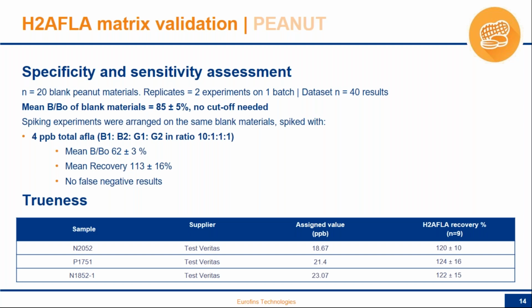We verified that they were blank, again, through instrumental verification, analyzed them in 2 sessions and found no matrix effect. We are very happy about this result because peanut could be a challenging matrix. We didn't need then to set any cutoff.